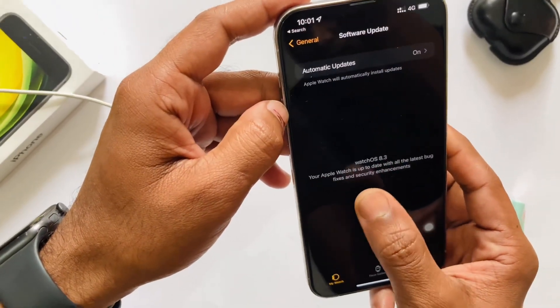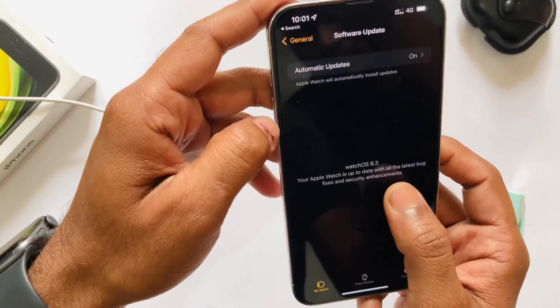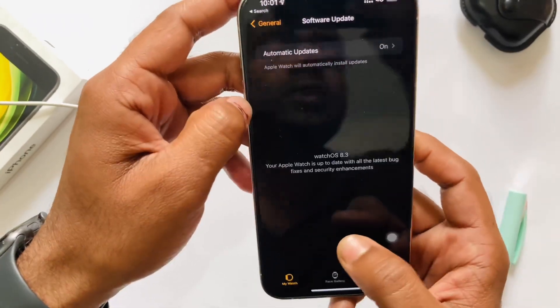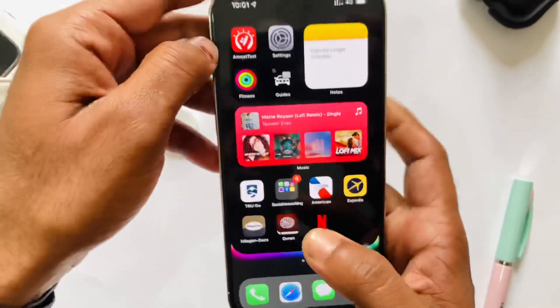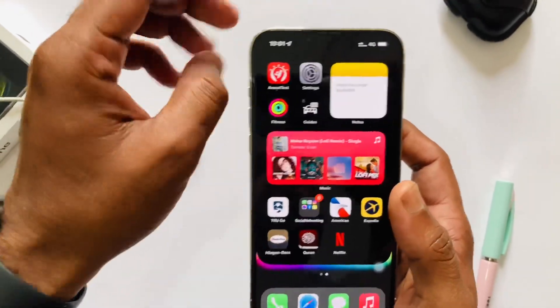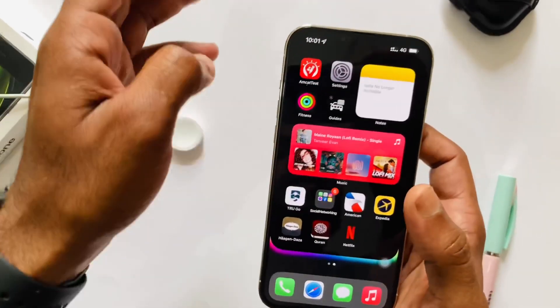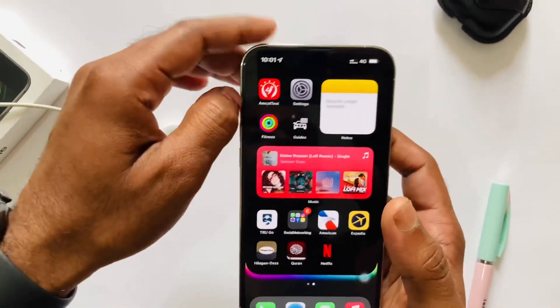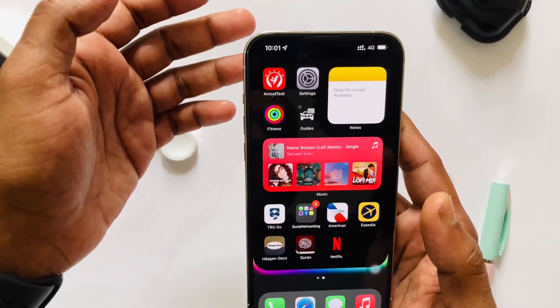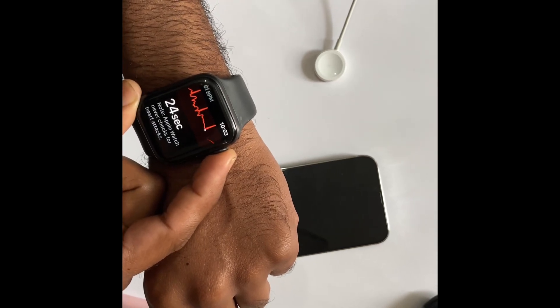After updating your Apple Watch, you have to reset your Apple Watch from the settings — phone settings. Before resetting your Apple Watch, make sure your Apple ID is signed out from your Apple Watch, because if you do the reset without signing out your Apple ID, it won't work properly.